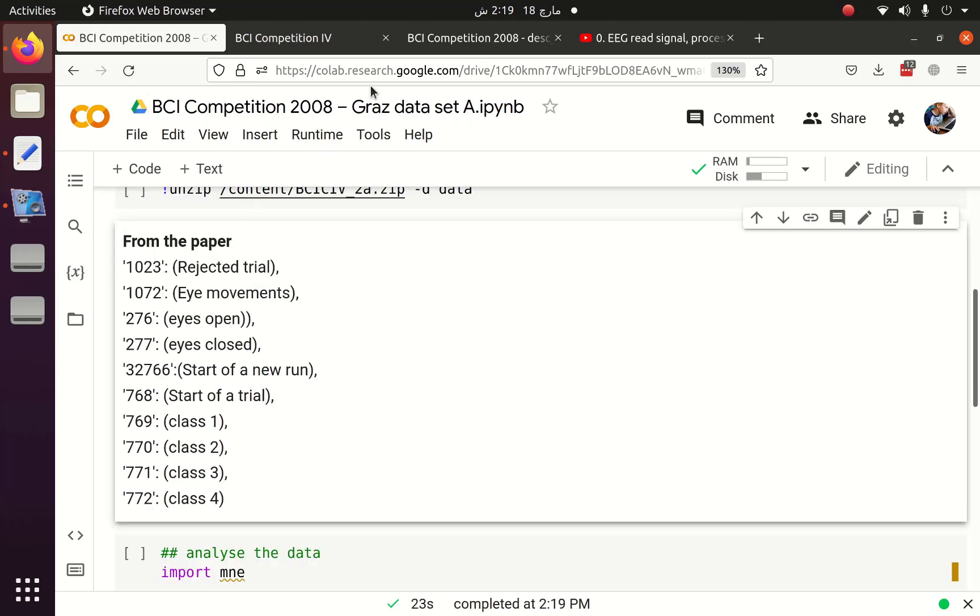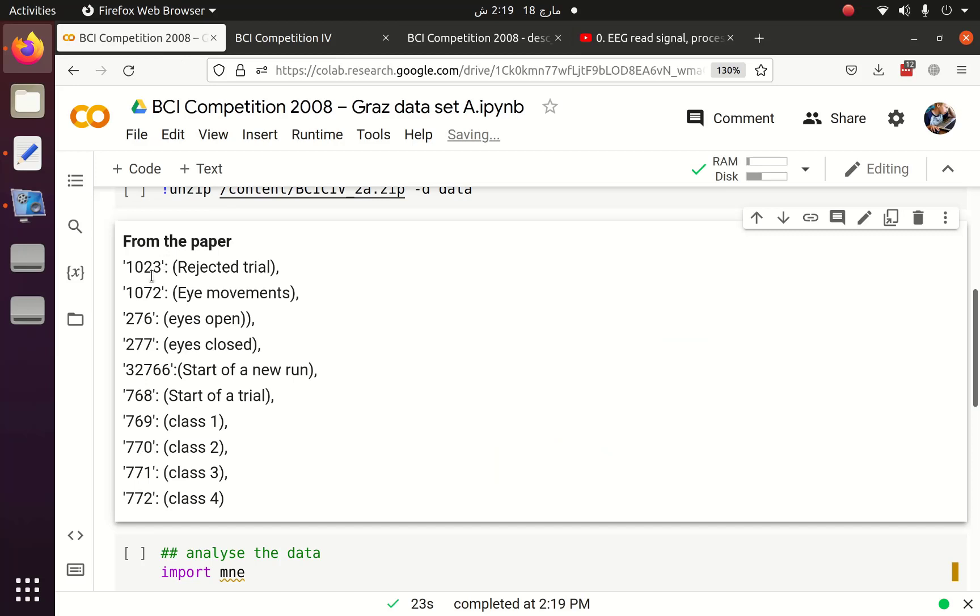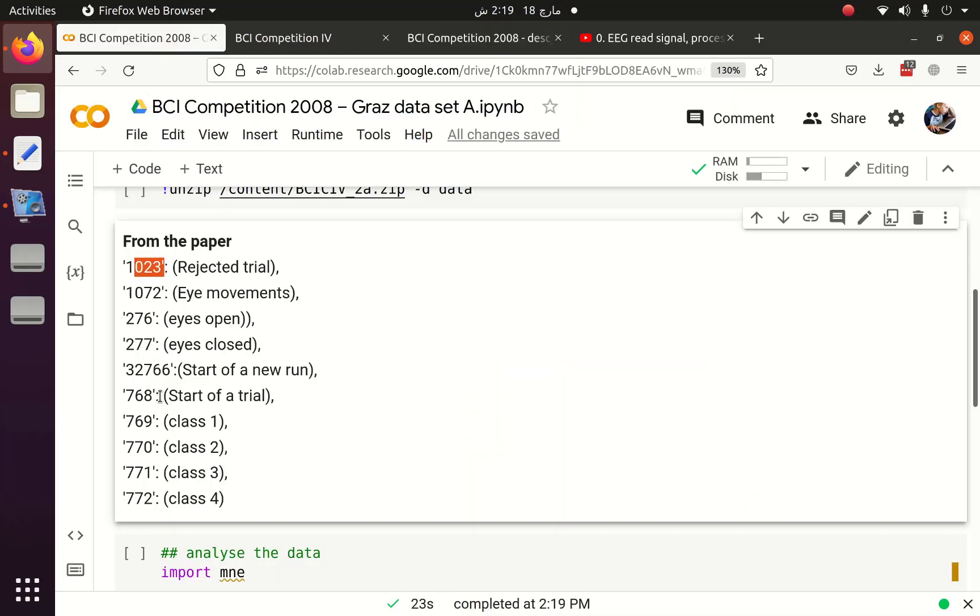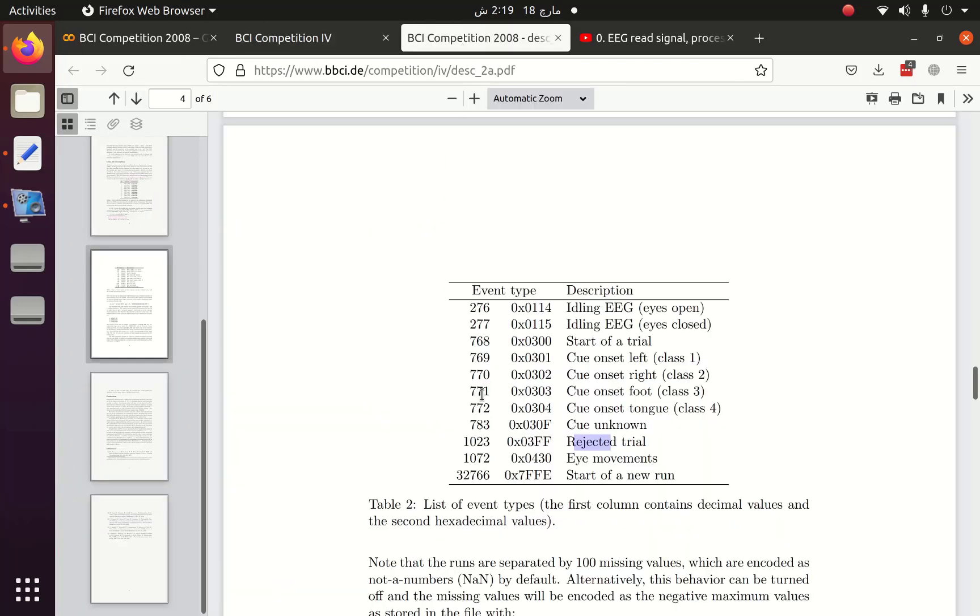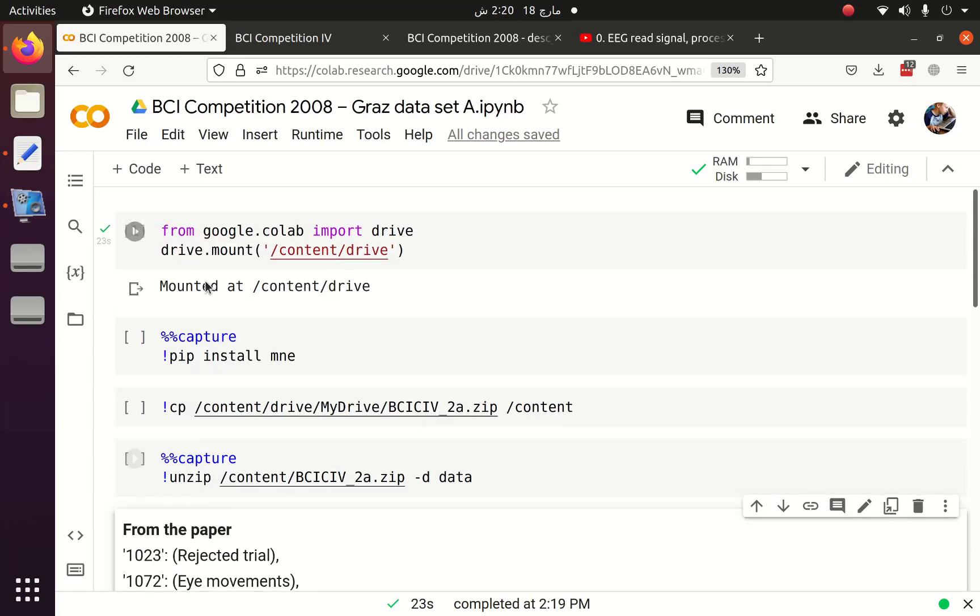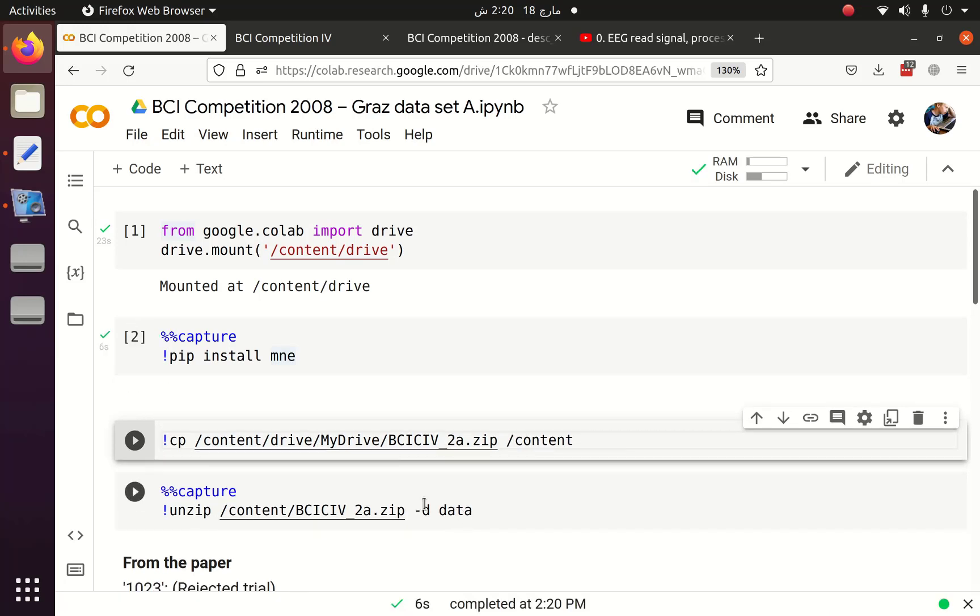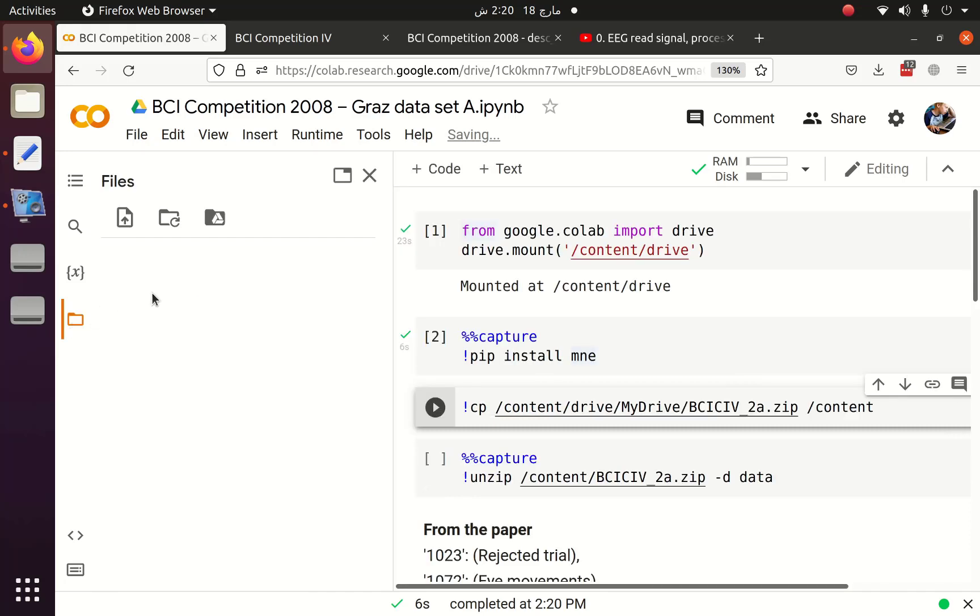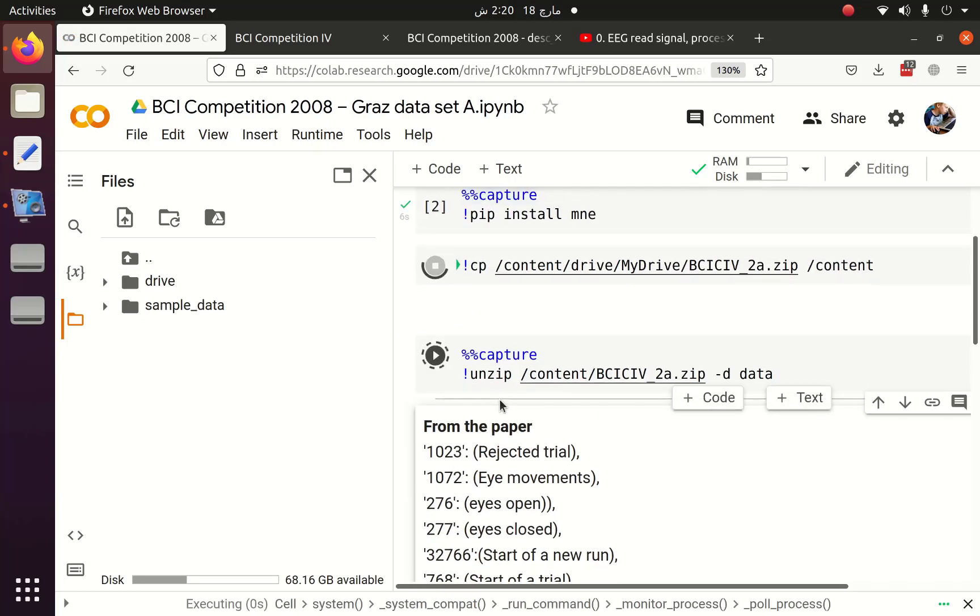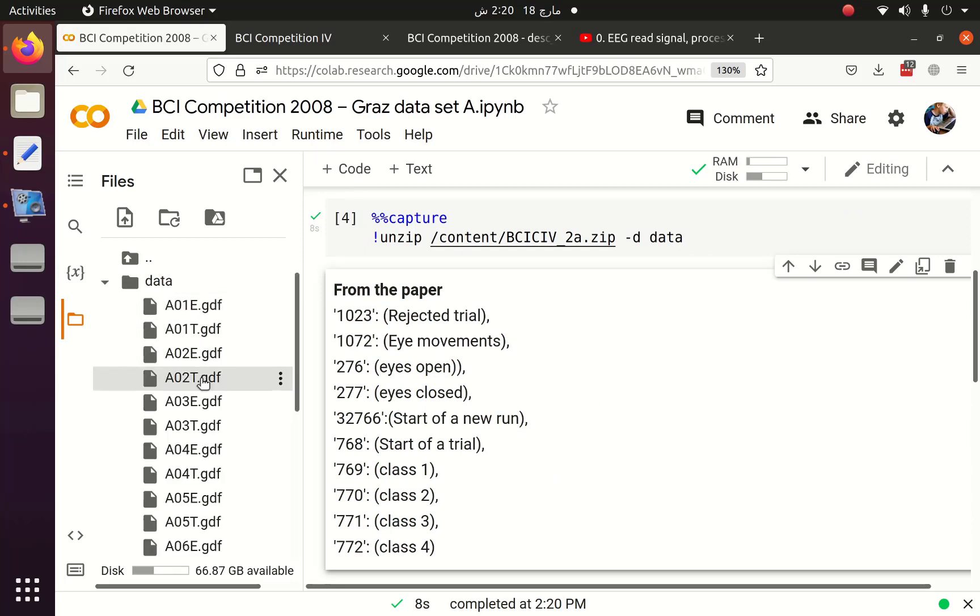From the paper, actually from this table, I have created this pair. 1023 is related to rejected trial. 768 is related to the start of our trial. So we are going to use this information later. Our Google Drive has been mounted. Now we are going to install MNE, and after that I will copy the content from the Google Drive to my Google Colab and then I will unzip the data into the data folder. You can see that currently there is no data because we haven't copied that from Google Drive. Now we are going to copy and unzip it. Now you can see that we have data and in the data we have multiple files.